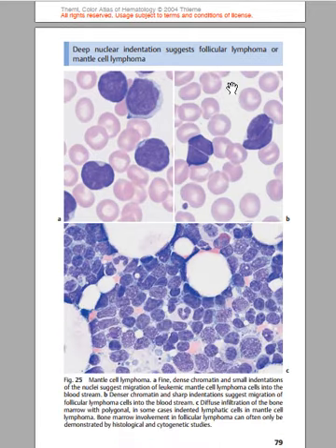So how do you visualize it? How do you visualize mantle cell lymphoma? So you have a diagram. A shows a dense chromatin. You can visualize dense chromatin here and a small indentation. You see dense chromatin, small indentation, dense chromatin, small indentation. Basically, this nuclear appearance suggests the migration of leukemic mantle cell lymphoma into the bloodstream.